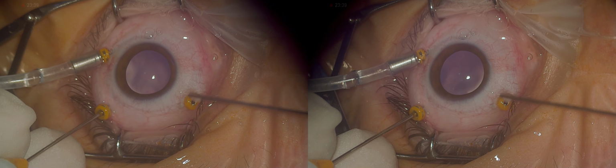After the retinotomy, it looks like a round tear was created, but actually the relief caused by the maneuver was responsible for flattening the retina at that location. More vitrectomy towards the vitreous base was carried out, attempting to remove all vitreous.